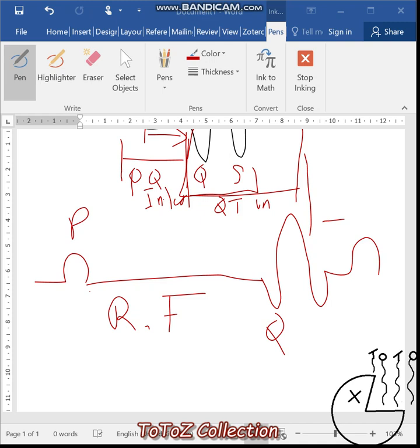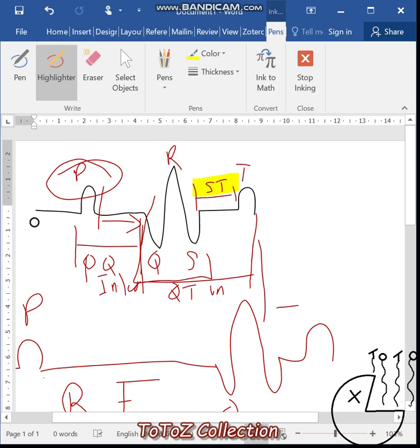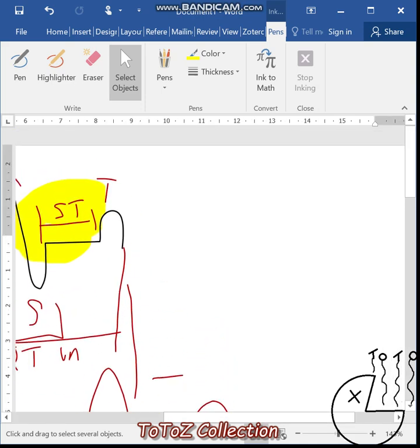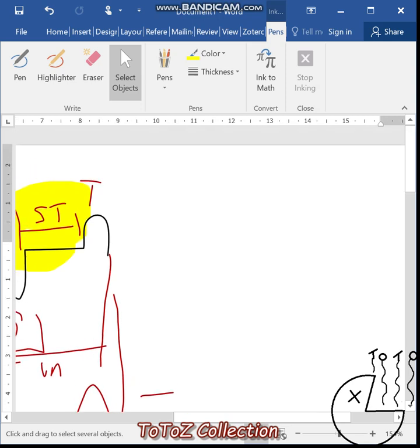And then the second one that you may have is going to affect the ST segment. Now if you look at your ST segment, it is that one over there. This ST segment we can either have it being elevated or we can have it being depressed. Now you have looked at angina pectoris, and you have different kinds of angina, unstable and stable angina, ST elevating and non-ST elevating. So we're going to get that therapeutics data and apply it with our physiology.